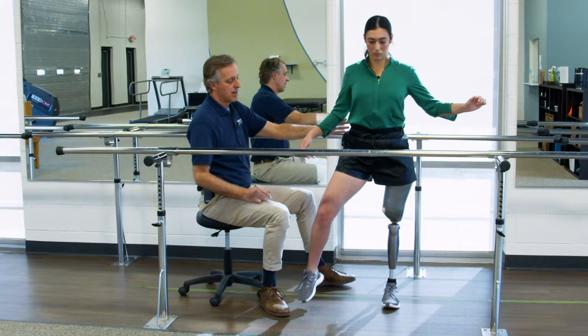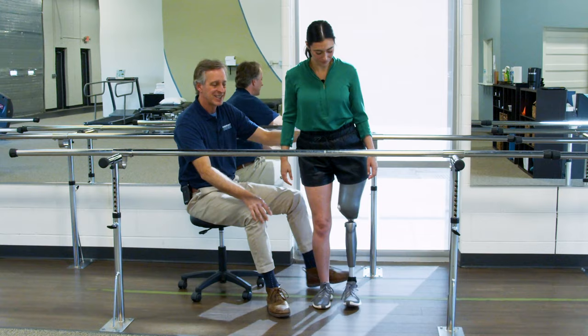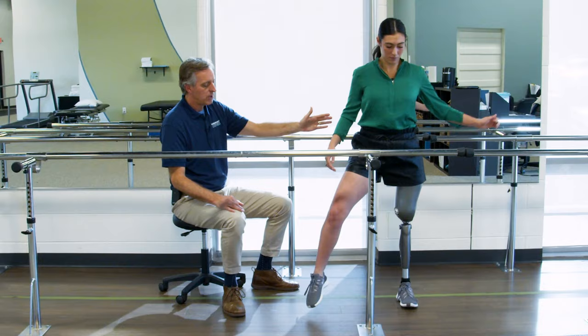And if she loses her balance at all, this is why you've got bars to hold on to, right? That's reality. This is not easy stuff, even if you're very good at it. This hold position, up, hold, and down. Up, hold, and down. Now hold for a second right there, Tracy.